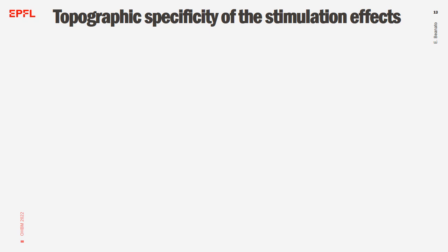Our main question was then to look whether the stimulation was affecting striatal activity. Thus, as a first step, we extracted the average BOLD activity within the striatal region of interest.